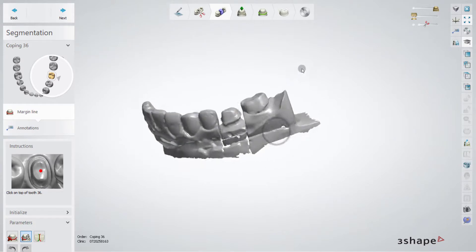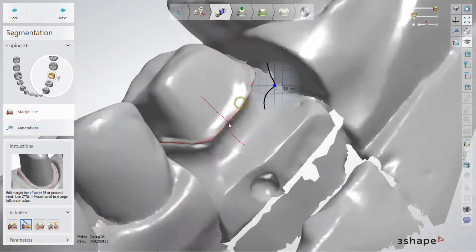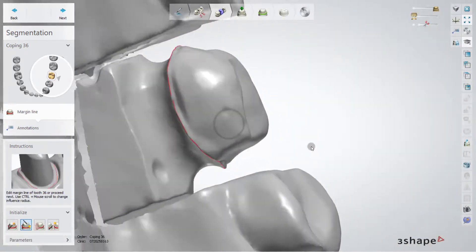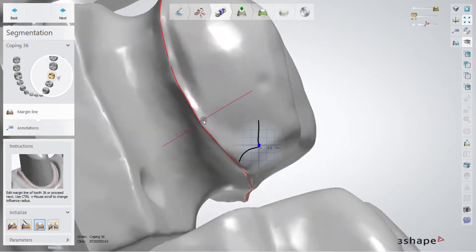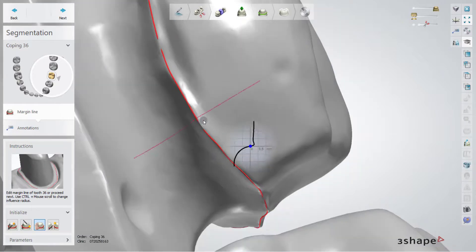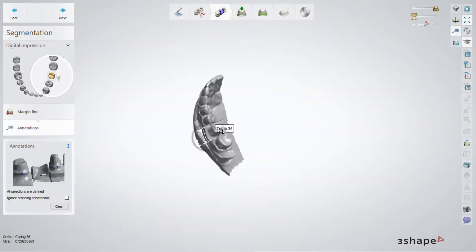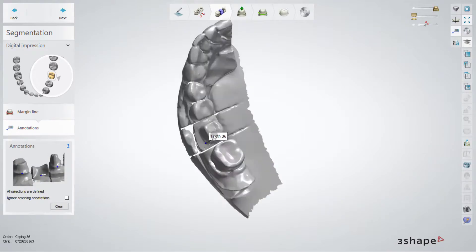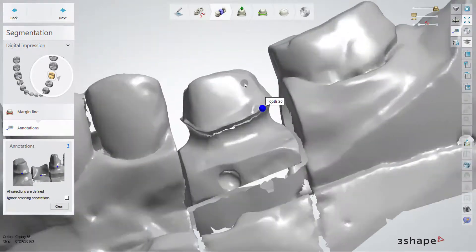In this part, we have to specify the margin line and check that it is correct.